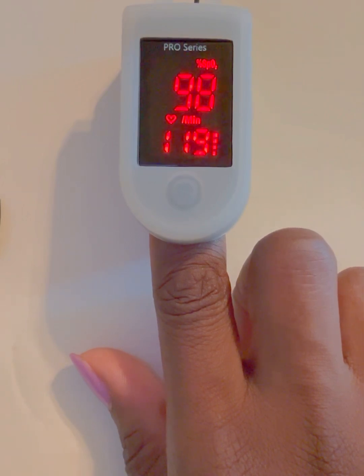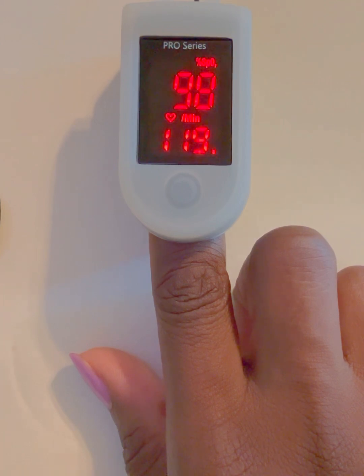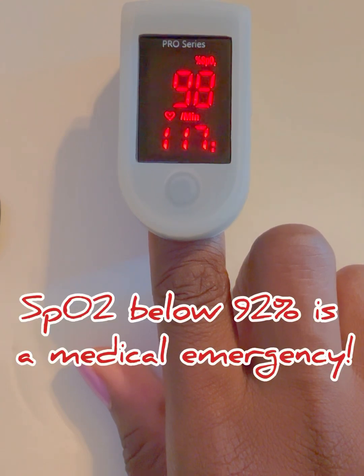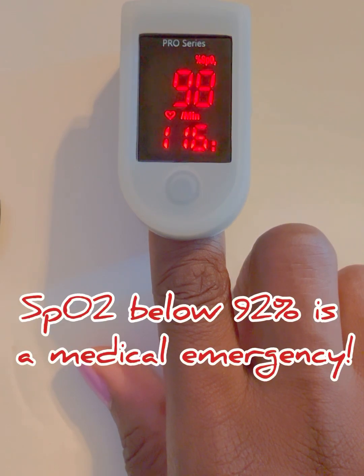A mildly low SpO2 is between 92% to 94%. With this you definitely want to monitor closely, especially if you have underlying conditions such as COPD, heart failure, COVID, asthma, or any other respiratory illness. If you're below 92%, this may be a sign of hypoxia, or low oxygen, and you want to seek medical help right away. Always consult with your healthcare provider about your levels, but oxygen levels below 92% is a medical emergency.